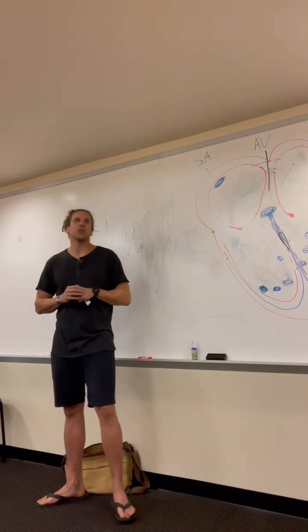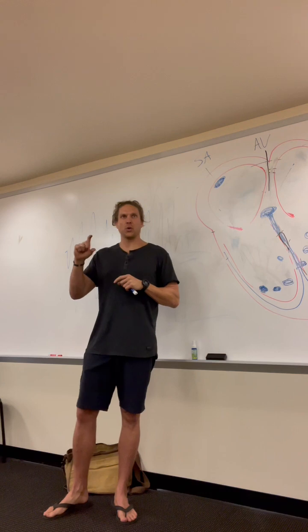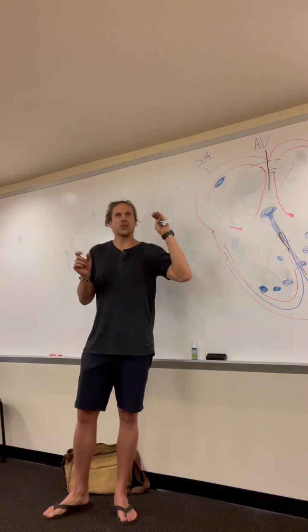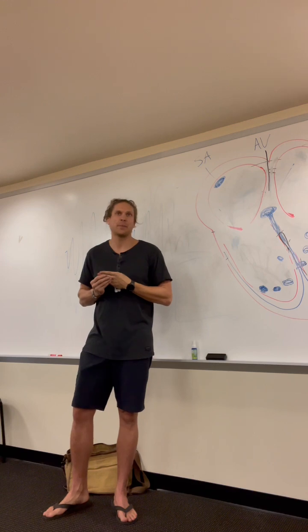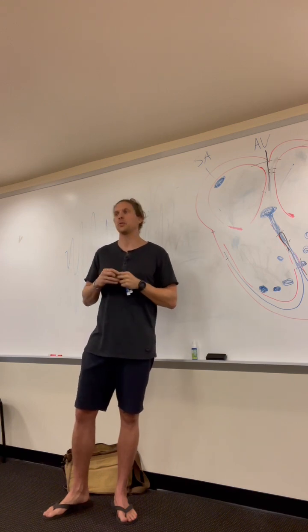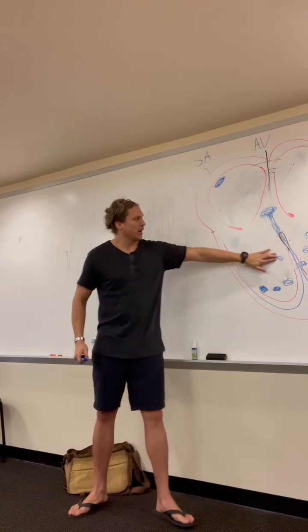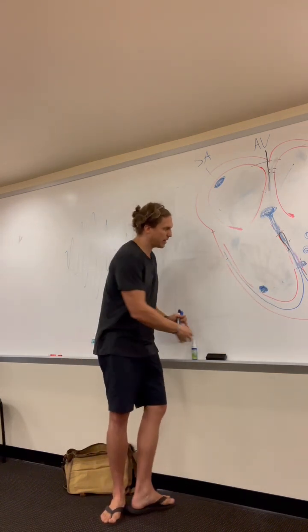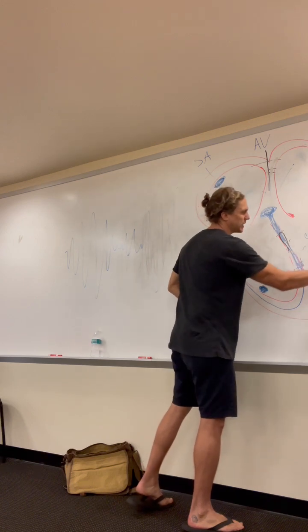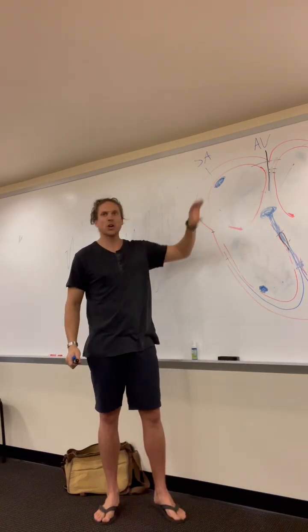Don't get this confused with agonal. I guarantee an agonal beat is under the classification of idioventricular rhythms. I didn't look it up, and I should have for you guys, but I bet you would find agonal under idioventriculars. Essentially, a focus down in the bottom of the heart didn't get any impulse, so it decided to become the primary pacemaker and start pacing for the heart.